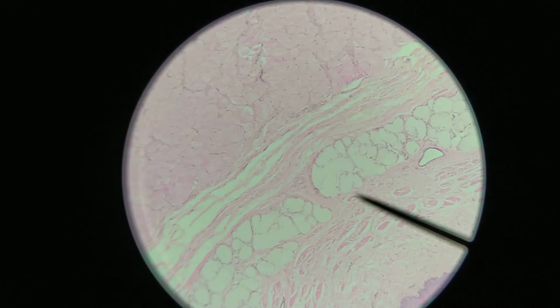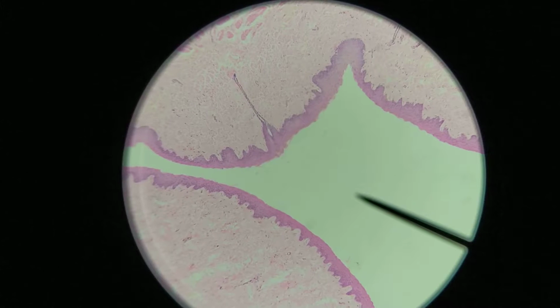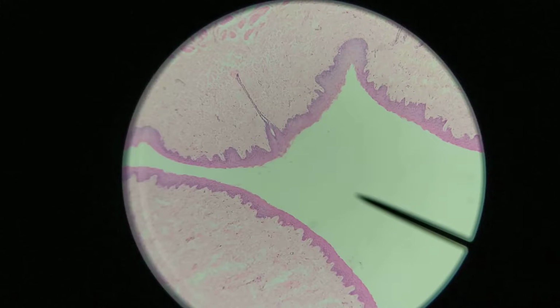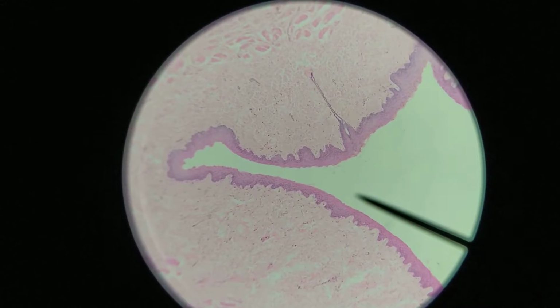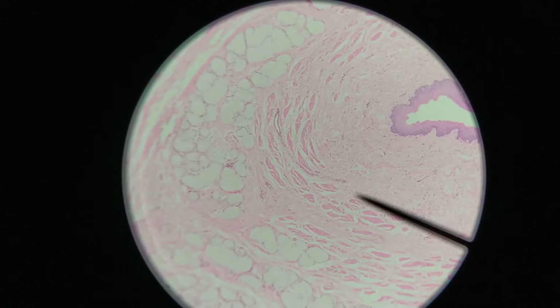Okay, so let's talk about the organization of this organ. What we're looking at right now, where the pointer is, is the lumen. Now around the inside of that lumen we have the epithelium. That's this here. This is a stratified squamous epithelium. We'll take a look at that in a moment in more detail. Beneath the epithelium is a layer of connective tissue. So from here to here is the lamina propria.